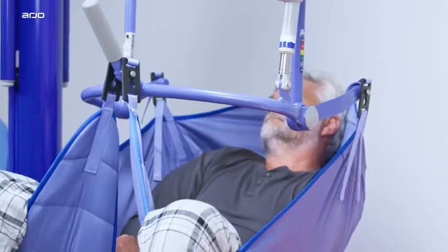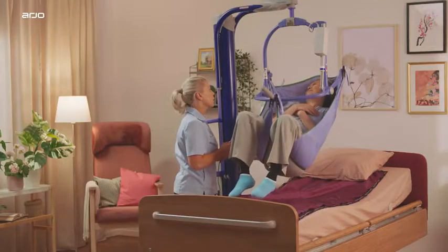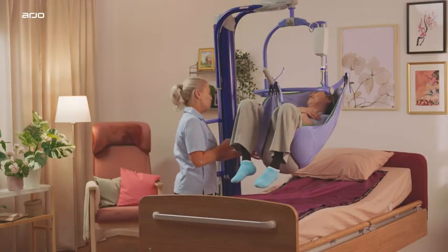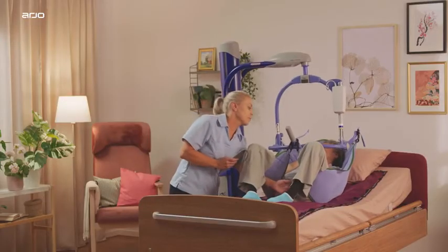The angle of recline can be adjusted for more comfort — press the image of the laying person to recline the PDPS. When lowering the patient back down, use the hand control to put the patient into a position that aligns with their destination. This minimizes lifting strain for the caregiver and ensures comfort for the patient or resident.